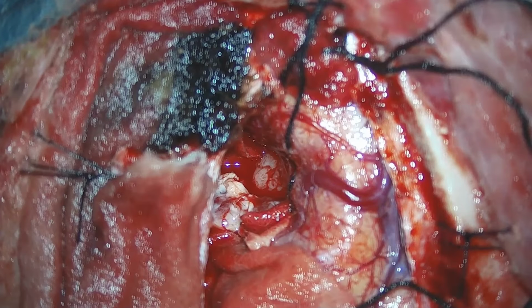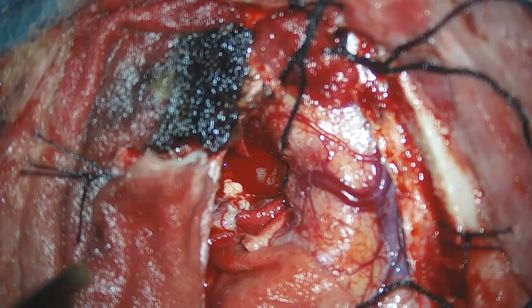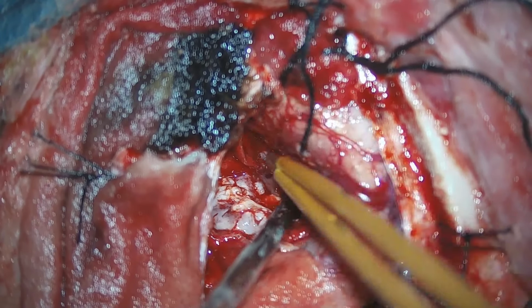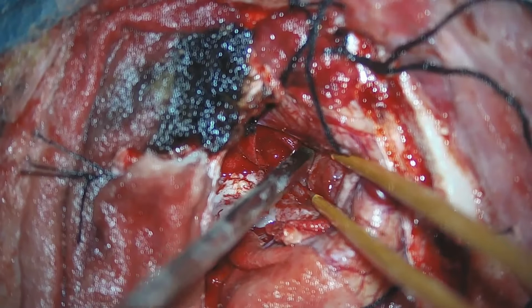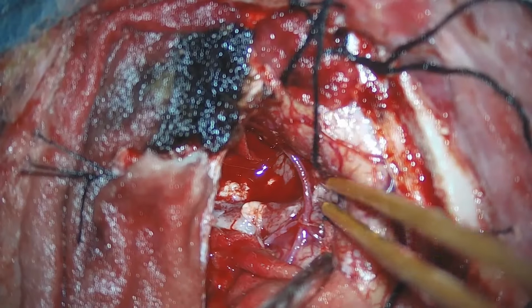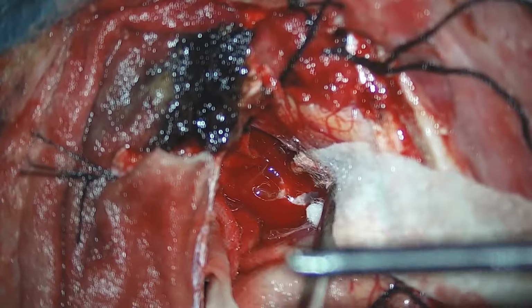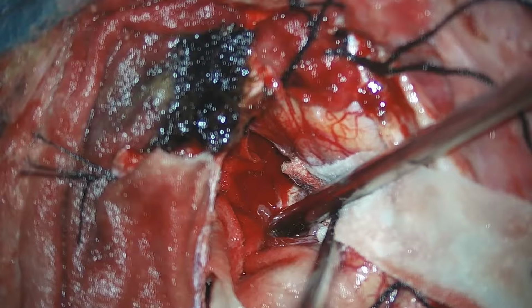Once adequate debulking has been achieved, we can again go for the creation of the plane between the tumor and the normal brain tissue. In all these steps, the cortical vein that we have identified earlier has to be preserved. Now we are using a debrider. As the tumor is very difficult for suction, we are using a debrider to slowly debulk the tumor.